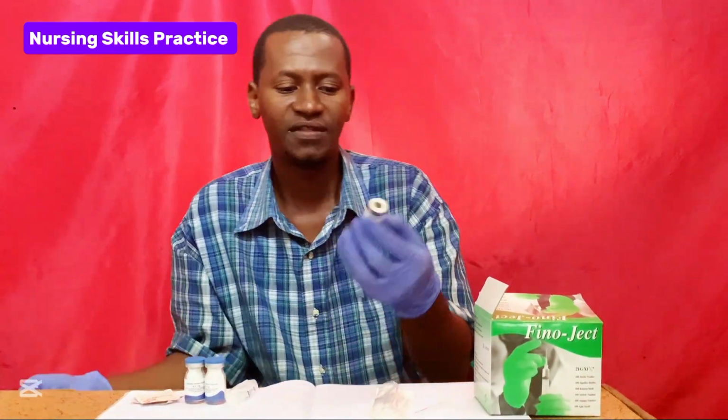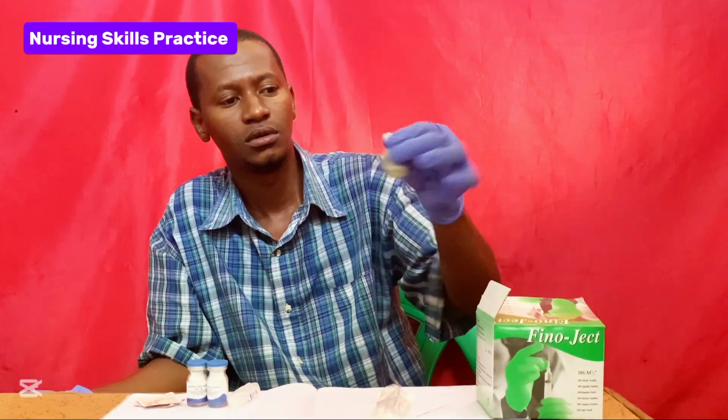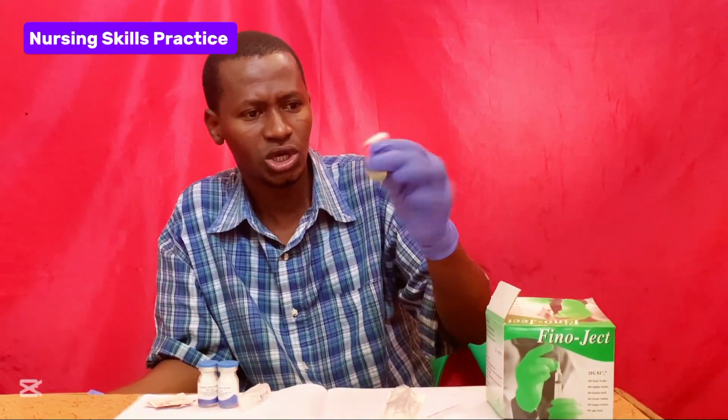You remove it, then you start shaking it gently like this. Make sure you shake it gently until all the solution is completely dissolved. Make sure you shake the vial gently so that all the drug can be completely dissolved.